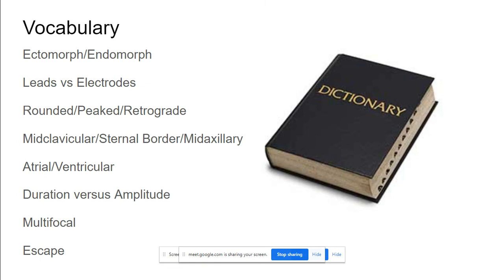If you are seeing a P wave that's upside down in lead 2, there is a conduction problem. Sometimes that can be from the result of a heart attack near the atria, from that coronary vessel, or there's other things that can cause that. But if you see the word retrograde, it just means negative or upside down. I noticed when I was reading through the book, when they're talking about P waves, sometimes they say negative depiction and sometimes they say retrograde. It looks like they don't use those consistently, but I wanted you to know what retrograde means.